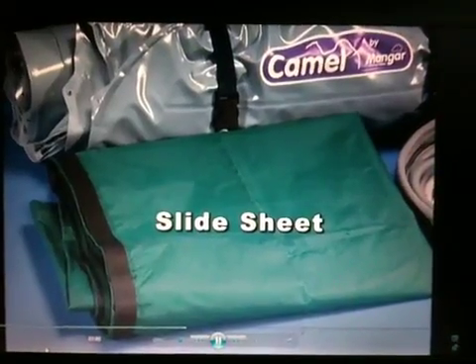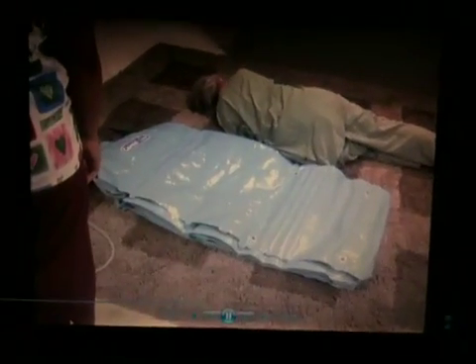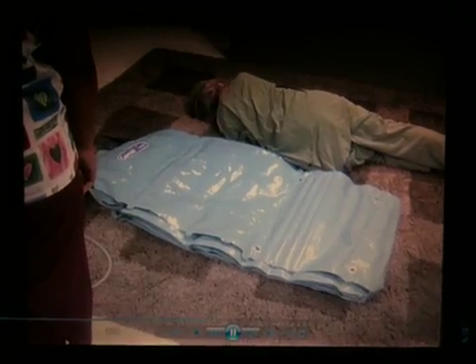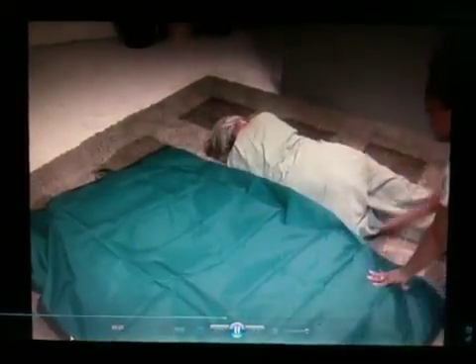If the person cannot or will not cooperate with the caregiver, the slide sheet is employed. To use the slide sheet, first position the person on their side facing away from the camel. Place the camel alongside the person with the logo near the back of their head. Place the slide sheet on top of the camel and then tuck it under the person.